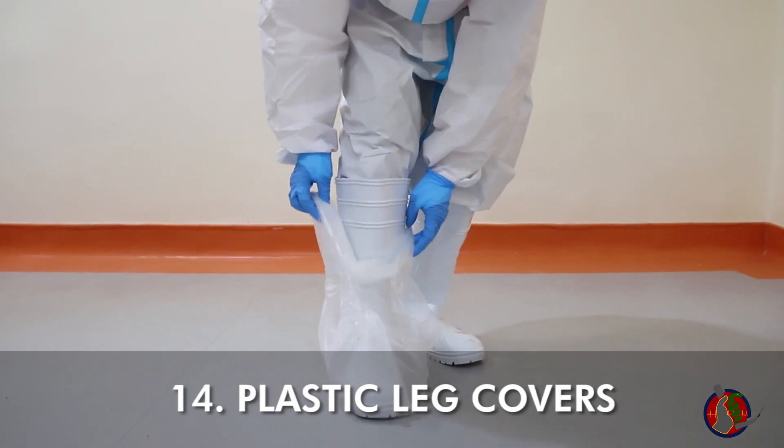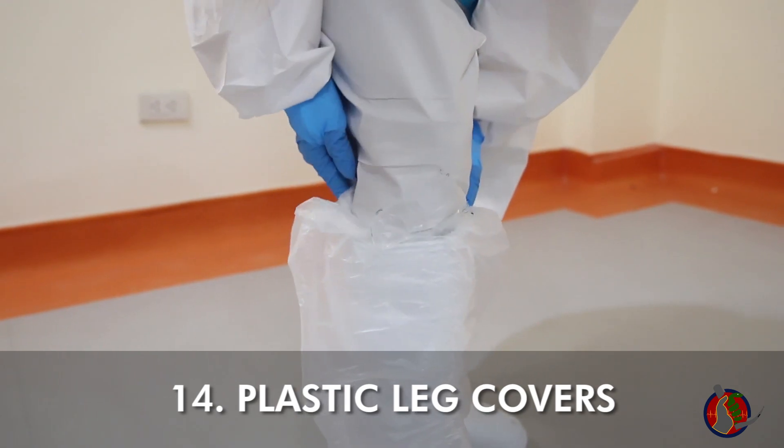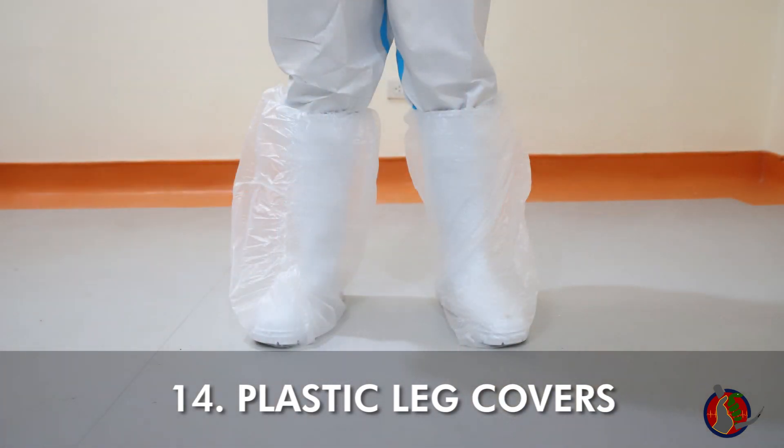Slip on plastic leg covers over rubber boots and tuck the edge of plastic inside the boots. Make sure the edge is not tucked too tight, which would make doffing the plastic covers more difficult.